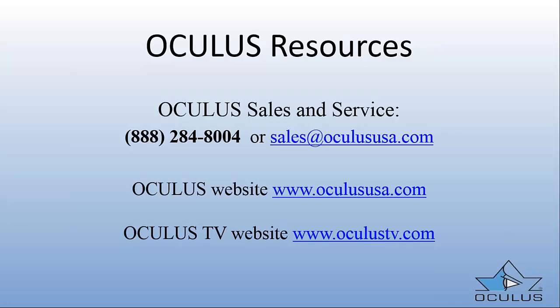The progression display is exactly what it is. It's to allow you to see when you have statistically significant change. And to me, it will probably become one of the most valuable tools in determining when and if patients should be treated. So they're all related, but they're all different.